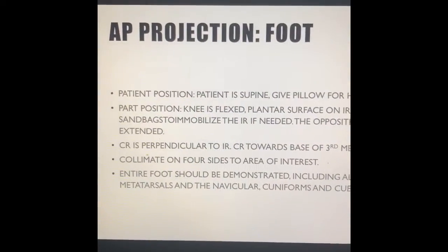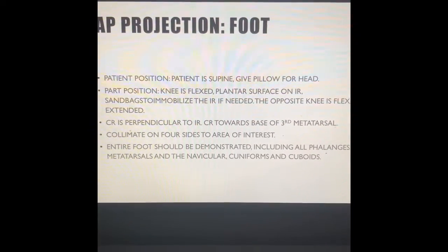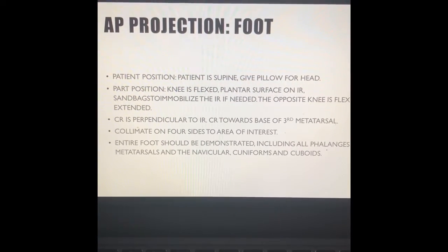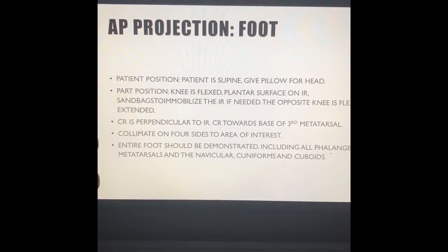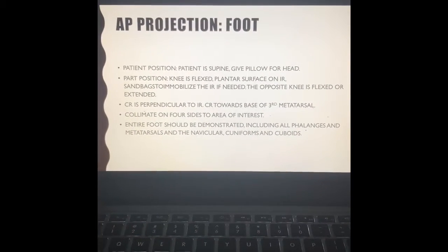The AP foot projection. Patient position. Patient is supine, and you can give a pillow for the head. Part position. Knee is flexed. Plantar surface is on IR. Sandbag can be used to immobilize the IR if needed. The opposite knee is flexed or extended.